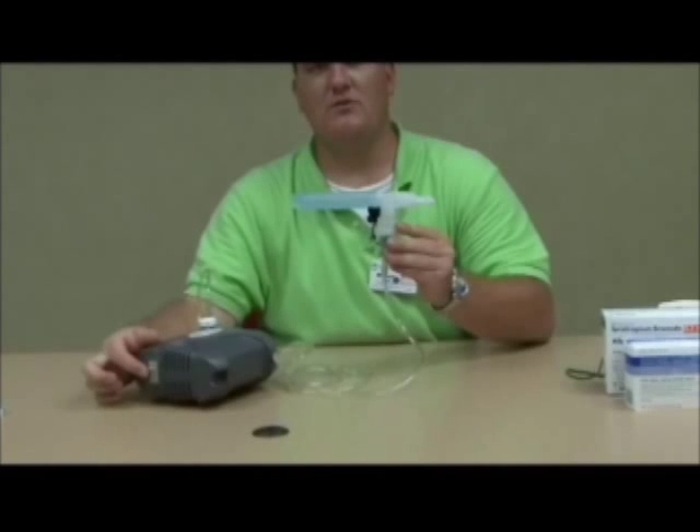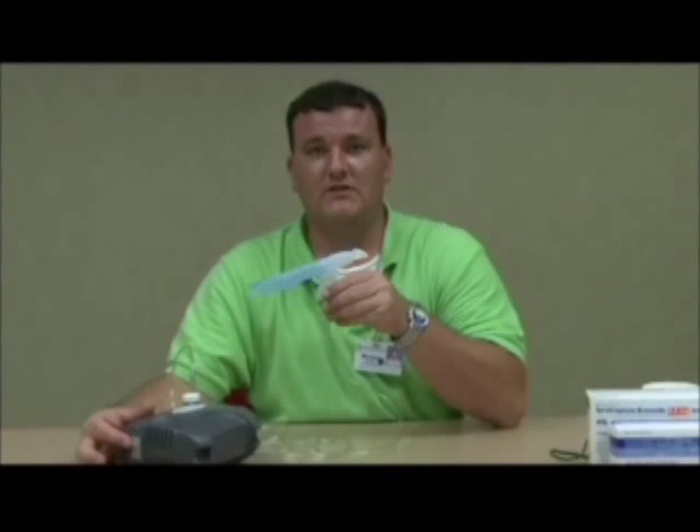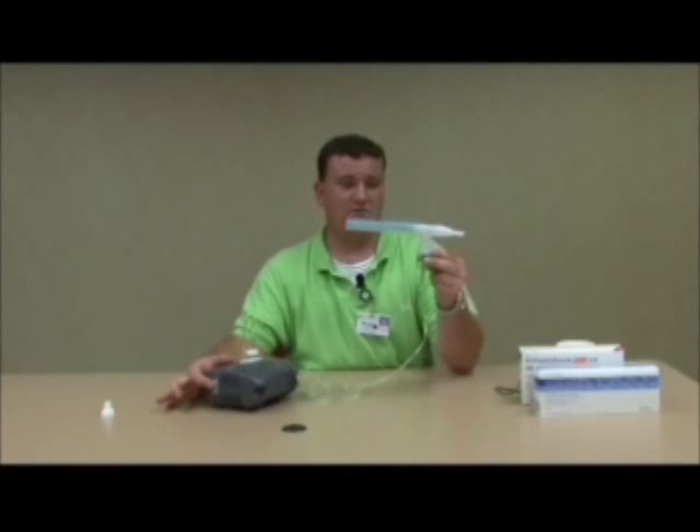Once you have put your nebulizer kit together correctly and have medication in there and are ready for your treatment, you will need to locate your power switch, which is on the side of the nebulizer. You will flip it up into the on position, place the mouthpiece in your mouth, take a breath and hold it for five seconds and release. The typical treatment should take about 10 to 15 minutes.